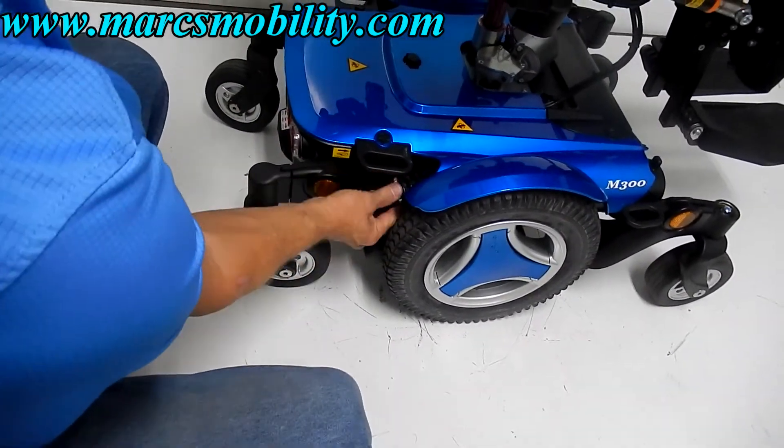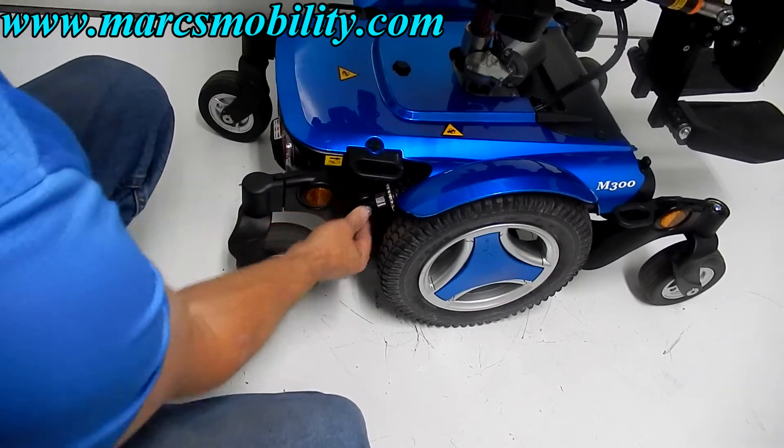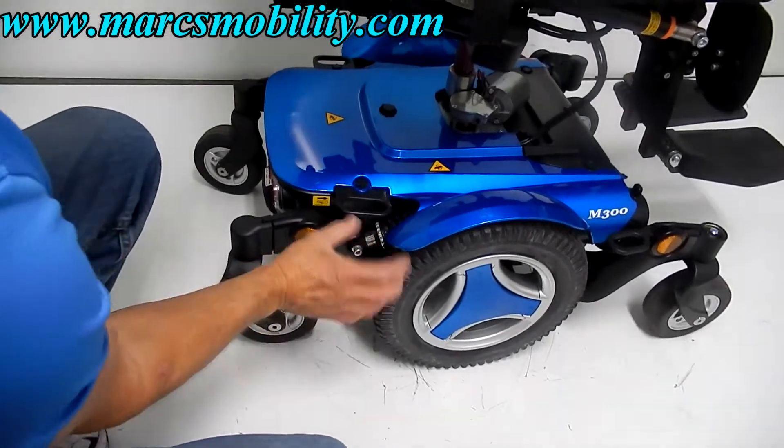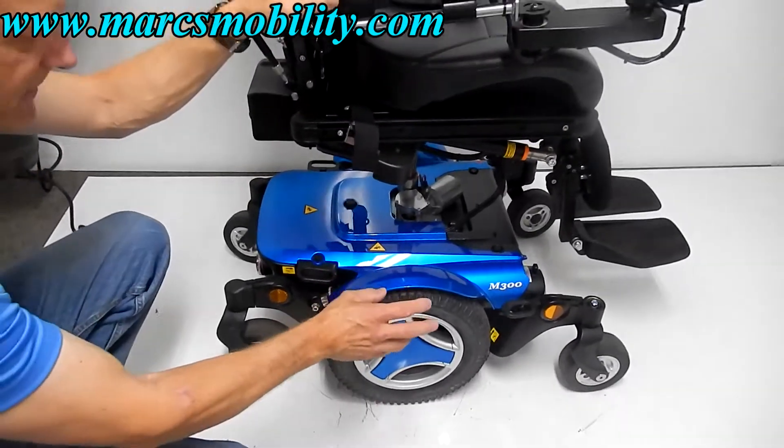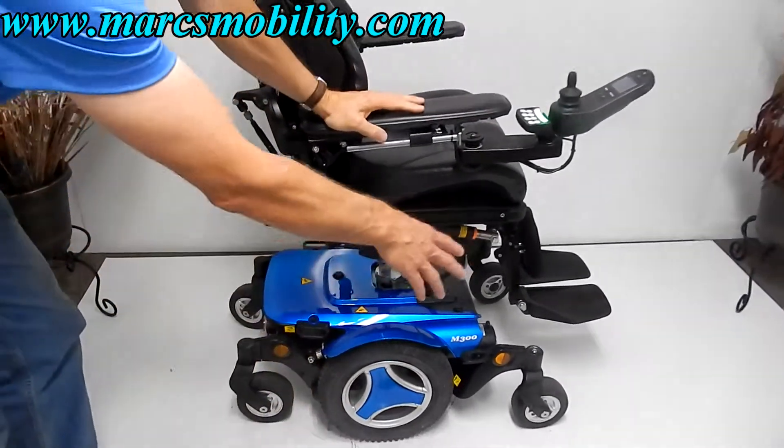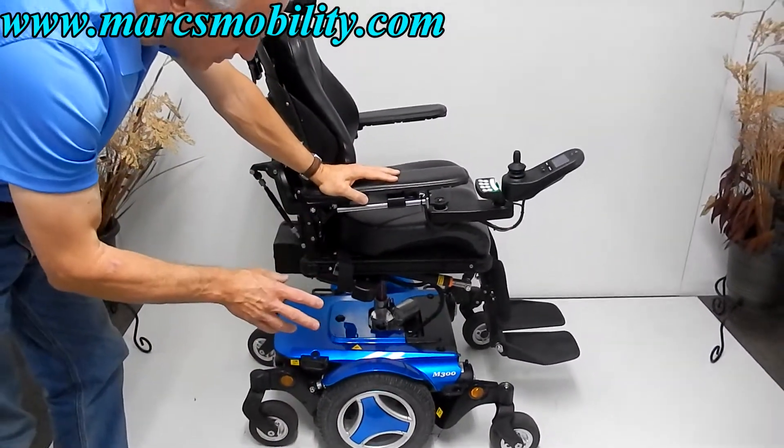The suspension can be adjusted by turning this knob. Tighter will give you a stiffer suspension, looser will give you a lighter suspension. So you've got your 14-inch drive wheels with great suspension on this chair.